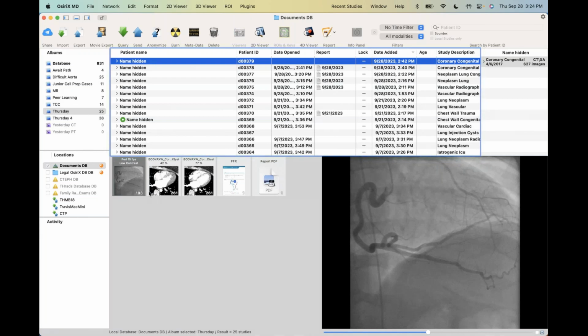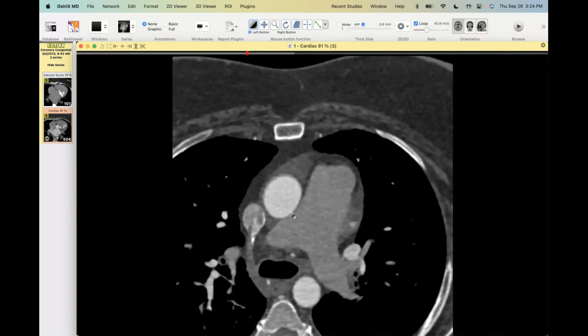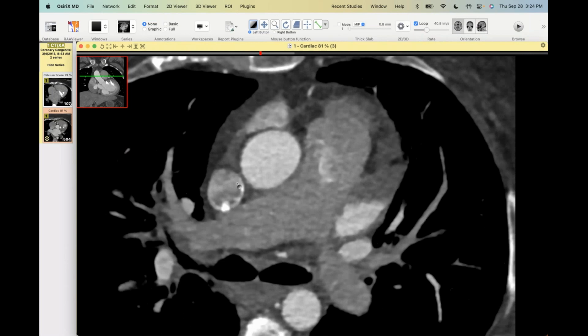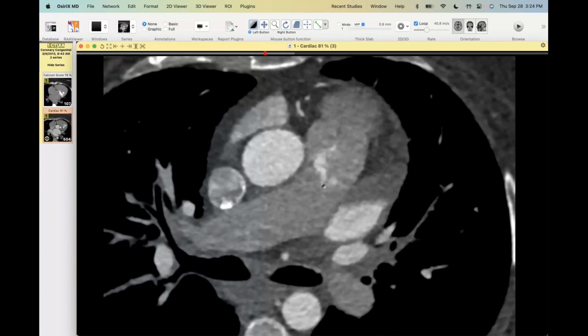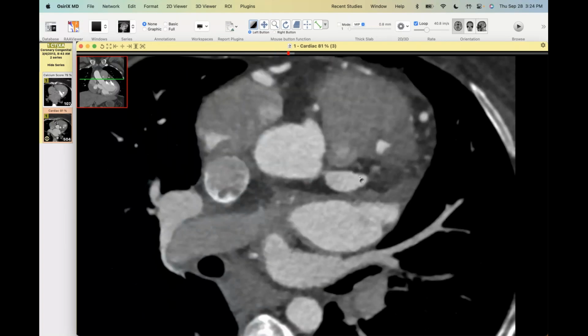I will. Okay, I'm going to show two cases of ALCAPA in adults, and neither of these are new; I've shown a couple before. I think the question today came up with physiology and direction of blood flow in pulmonary arteries. This is an adult, and this patient did undergo reimplantation. You can already see on this coronary CT that there's a blush of contrast sitting in the middle of the pulmonary artery, and that in fact comes from the left coronary artery, which is huge.